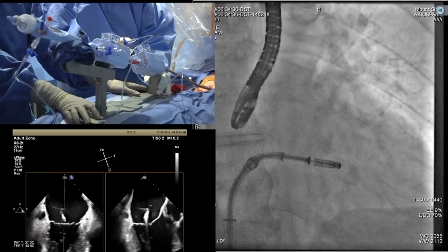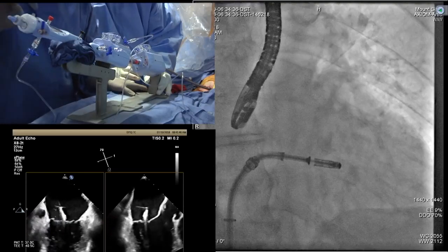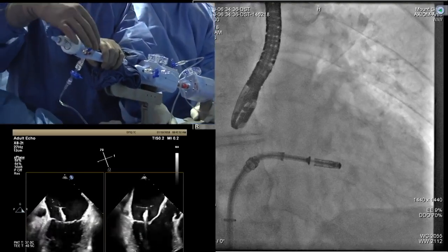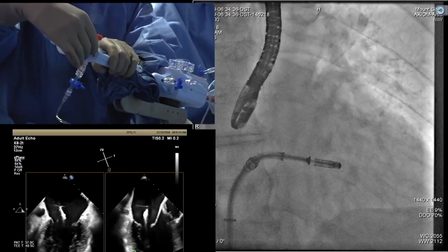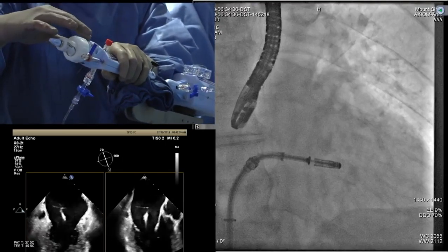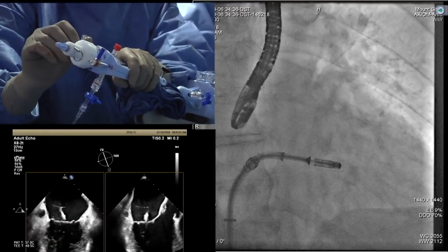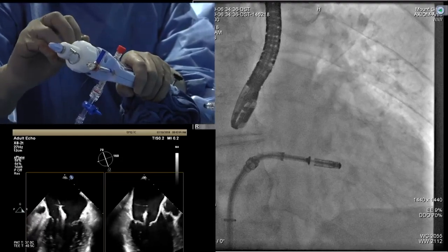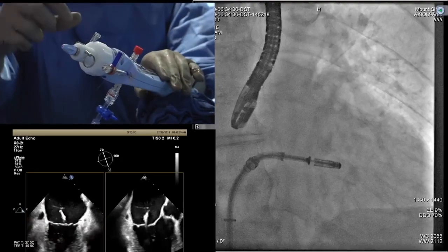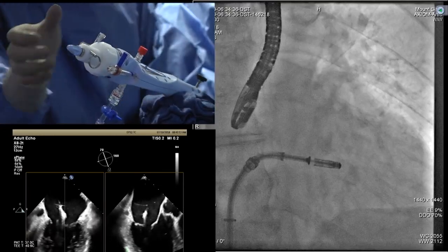So now do we open? Yes, a very important part is opening. What you do is you take the grippers. You see this? These are the grippers. You just pull back till you see the nice blue ring. Close it. Good. Same thing with the clip: you pull back, unlocking so that you can see the blue line, and then you move it so that it's unlocked now. It's open. Good, and you can leave it open now.